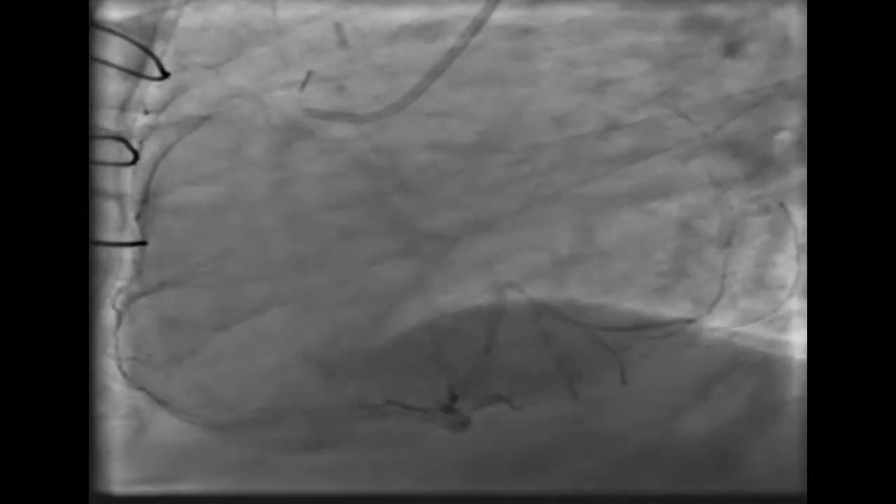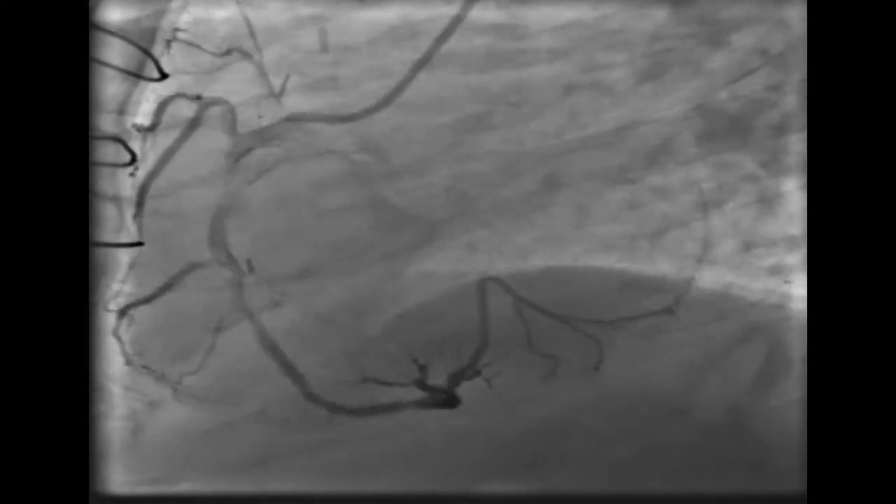This is the same graft. The right coronary artery showed non-significant lesions, and it filled the left system retrogradely.